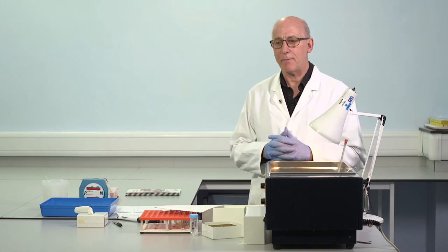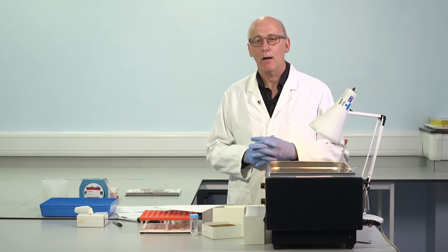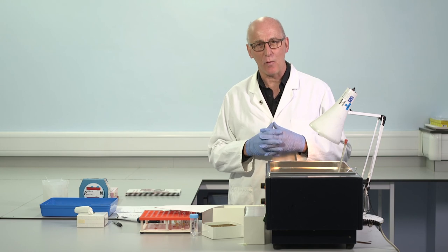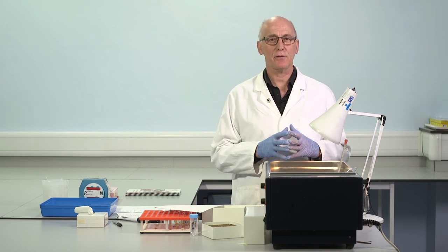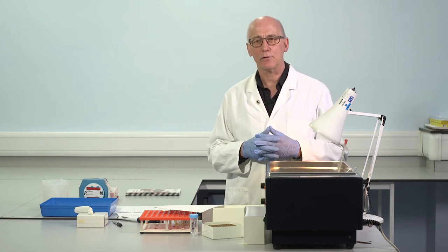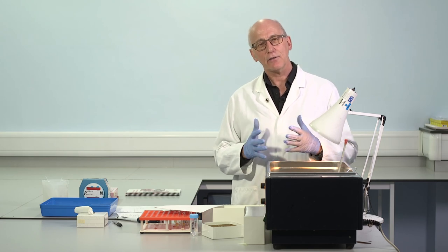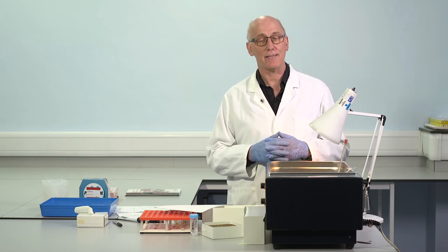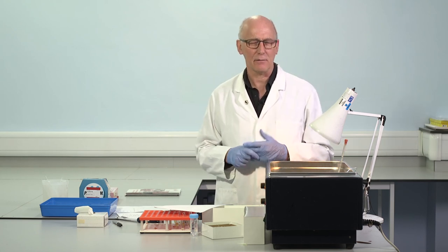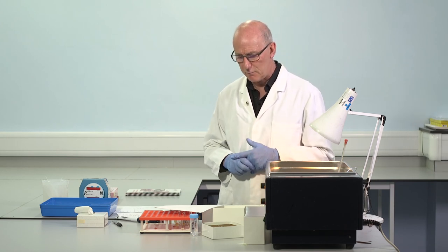A few final comments about APTT that we did not yet get a chance to make. Another variation between reagents is in relation to factor 12 deficiency. Factor 12 deficiency is not associated with bleeding. Relatively common amongst hospital populations, at least mild deficiency. And this can prolong the APTT with some reagents more than with others. So the detection rate, or the number of such samples with prolonged APTT, also varies a little bit between reagents.